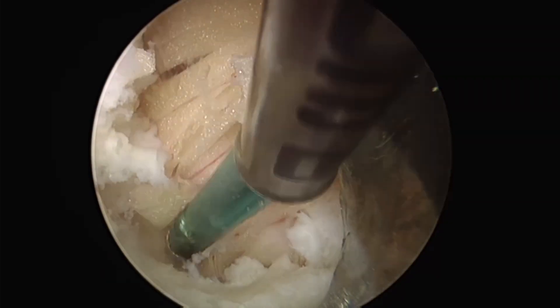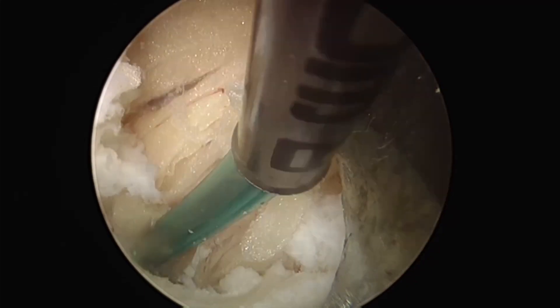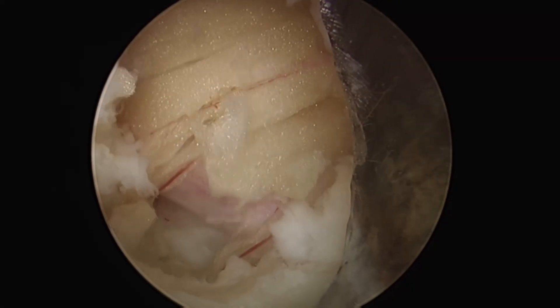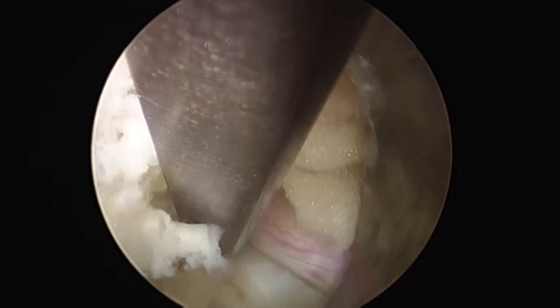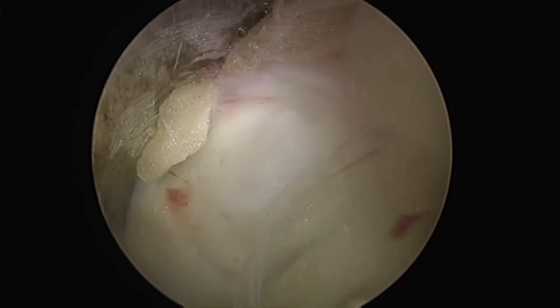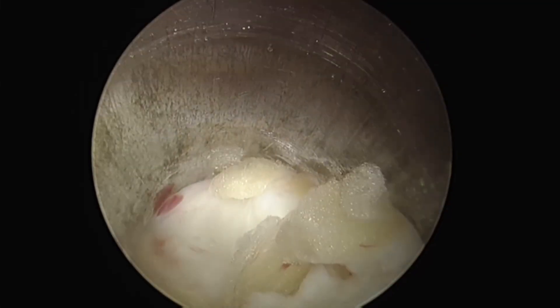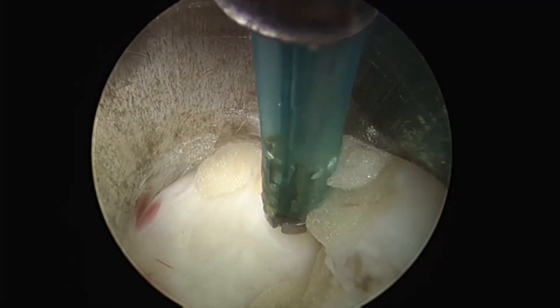After cauterizing the lateral aspect of the root with the bipolar and confirming its mobility, the root is retracted. The sleeve is retracted to reach the disc. As a key step, rotating the sleeve while contacting the disc allows the nerve to be retracted easily. By aligning the sleeve with the same layer as the disc, the dorsal root can be retracted.